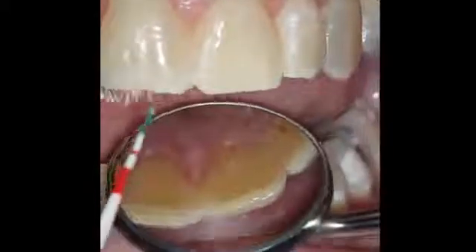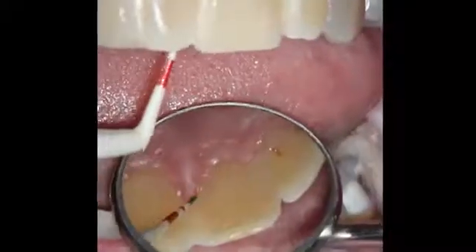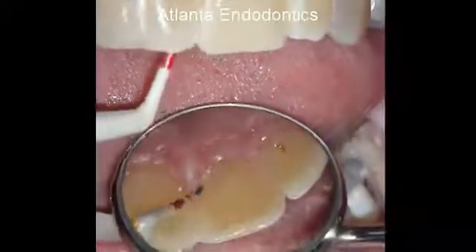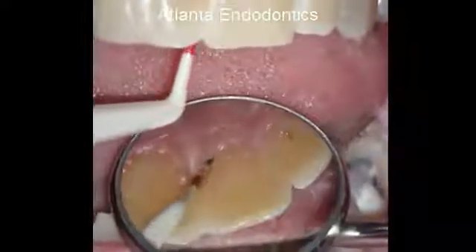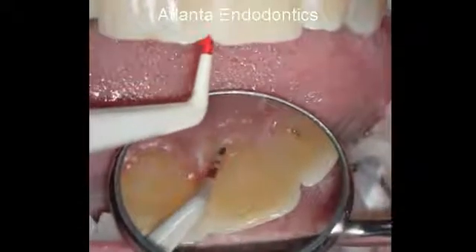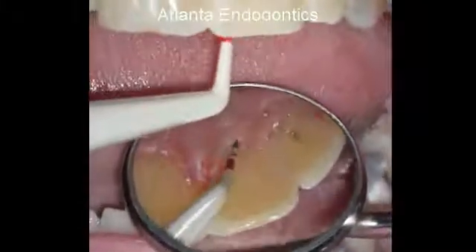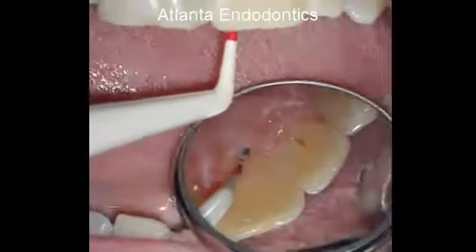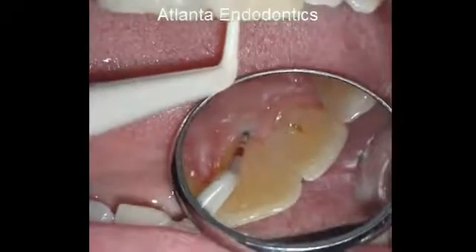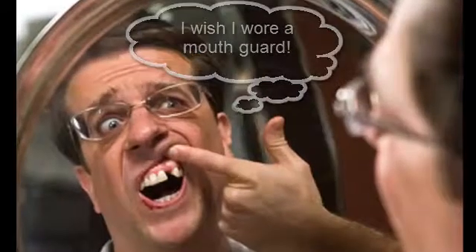In this particular case, what was interesting is that the periodontal ligament was intact around the coronal surface of the tooth. There were no probing depths present. So, if you're out there playing contact sports, be smart. Wear a mouth guard.